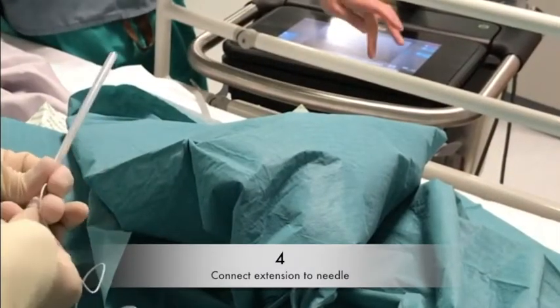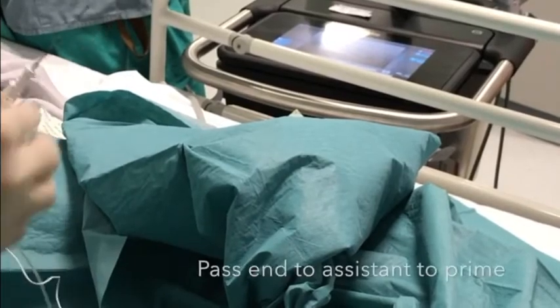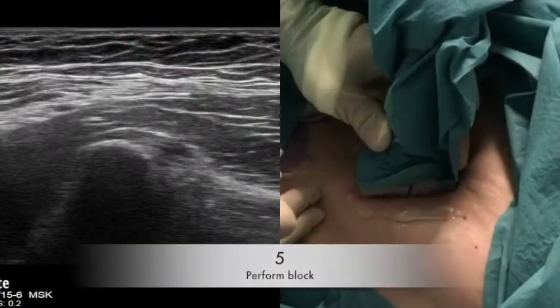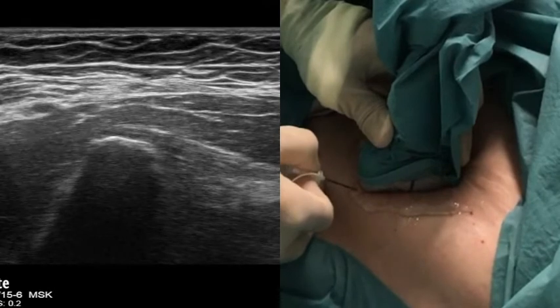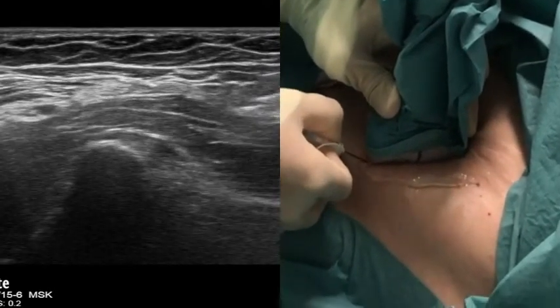Step 4 is to connect one end of the extension tubing to your needle and pass the other end to your assistant who can prime it with local anaesthetic. Step 5: now it is time to perform the block. Warn the patient that they will feel some pressure on their groin area and then puncture the skin. This will take some force as the needle is not sharp.